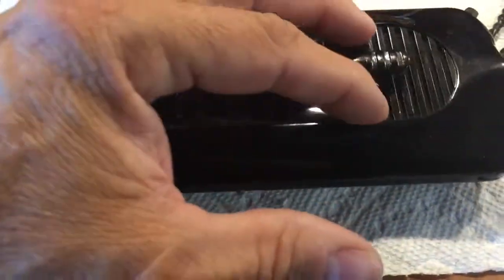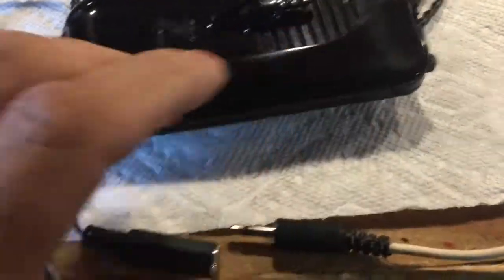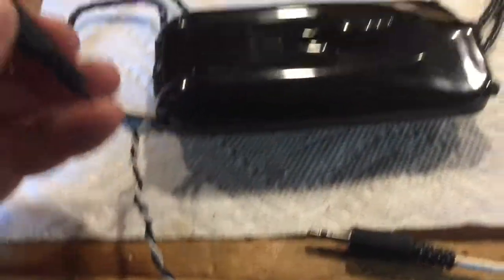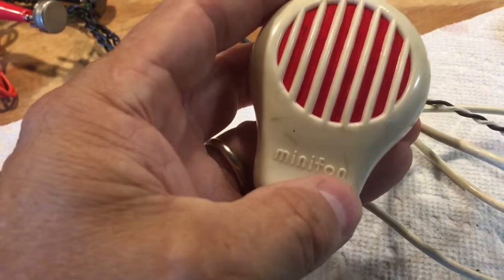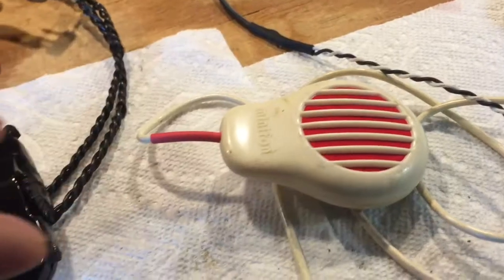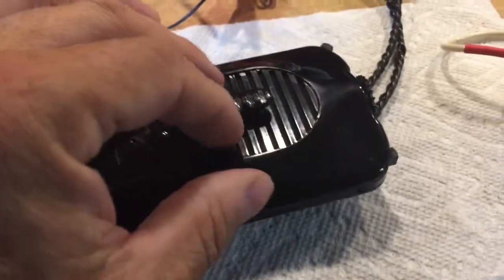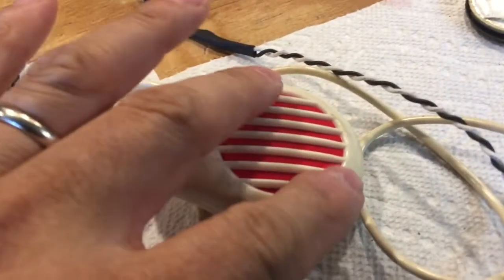I replaced the microphone with an external connection I created — tapped off of the microphone wires inside the hearing aid, with a jack here as you can see. I connected this crystal microphone from a previous project — the mini phone, the secret agent man recorder. It's a crystal microphone, just like the original, except about twice the diameter, so it wouldn't fit inside the hearing aid.